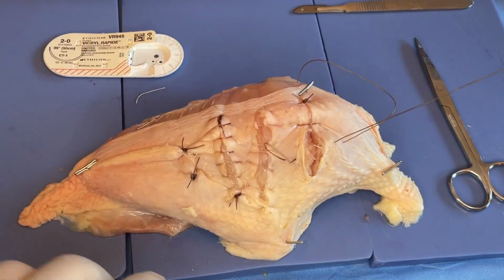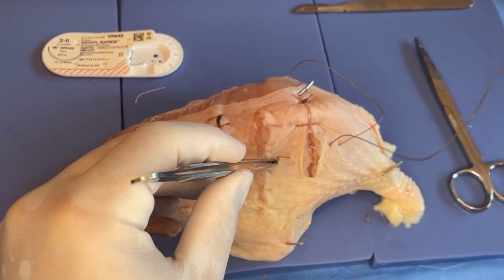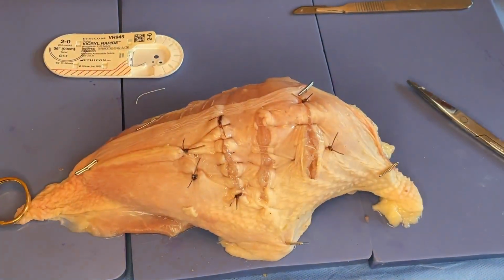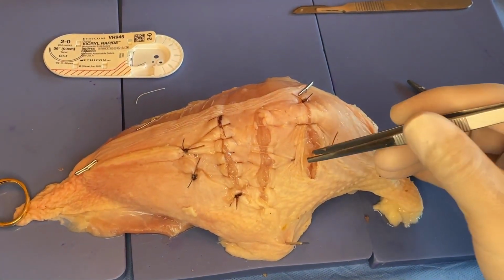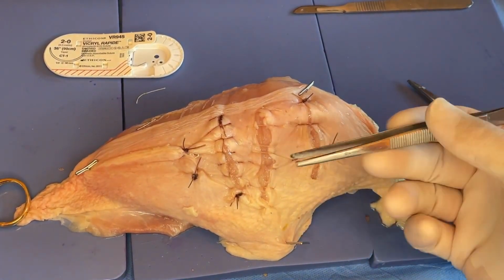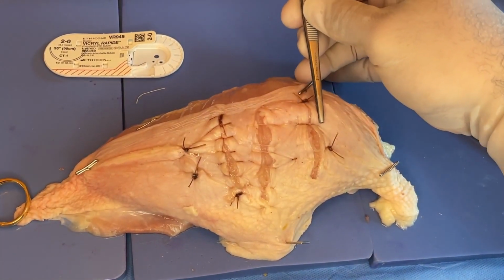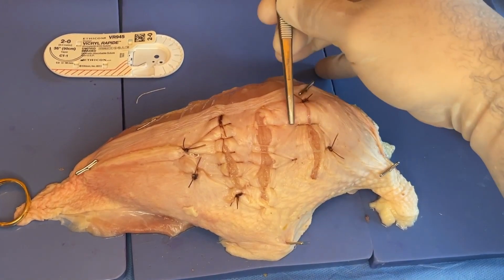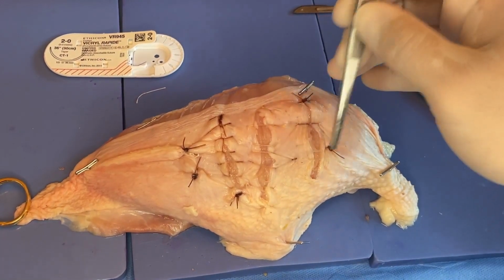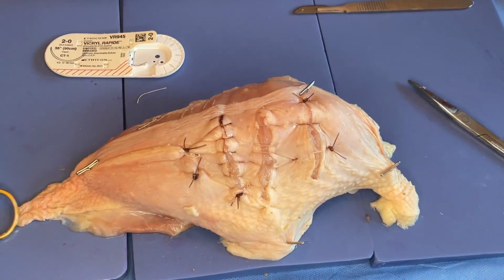So again, we've got that more distributed tension with the suture. You can see that we're quite a way further from the skin edge than we are with, say, our interrupted. So what we've done here is, again, a much broader compression of the defect, but the orientation of the suture that we've been driving was perpendicular. Here, with the horizontal mattress, we were driving the needle parallel to the defect and not really passing the needle through the defect. Here with the vertical, we did pass the needle across the defect, from further out and then from closer in. Let's just do one more of those.